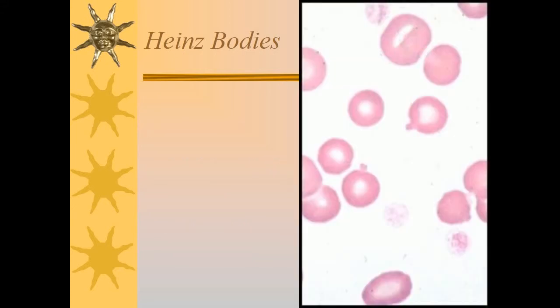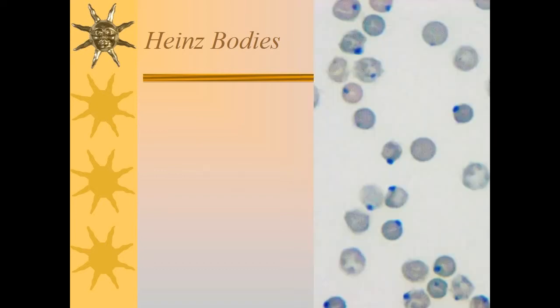In this slide you can see several unstained Heinz bodies. Heinz bodies are always easier to visualize if they have been stained with new methylene blue, as seen in this slide.